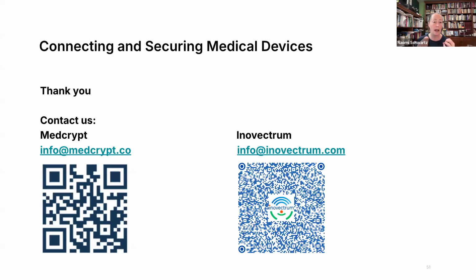Typically, no. However, when your devices are disposable like a CGM, if you're just tossing it in your residential trash and somebody says, oh, I want to go and reverse engineer the thing, as a manufacturer, you should consider whether or not your IP can be stolen. So it's not just the risk to the patient, it's a question of protecting your business interests as well. Would I recommend that you test to that degree to understand your business risk? Yes. Is that necessary from the safety and effectiveness perspective for FDA? Not always. You do want to make sure it's sealed, though.